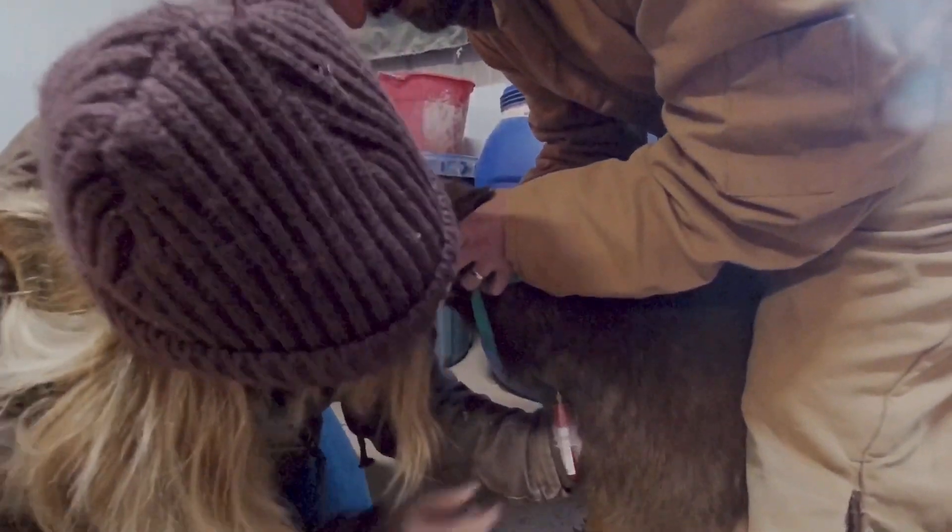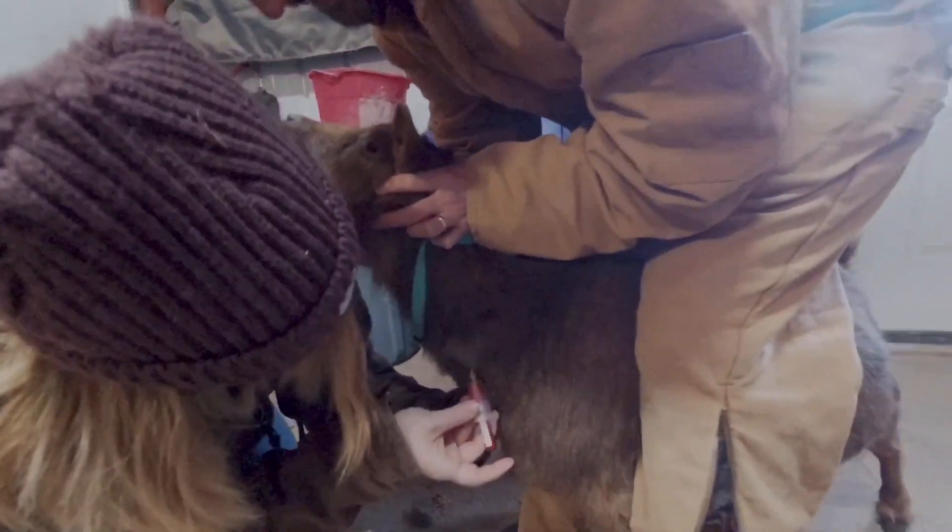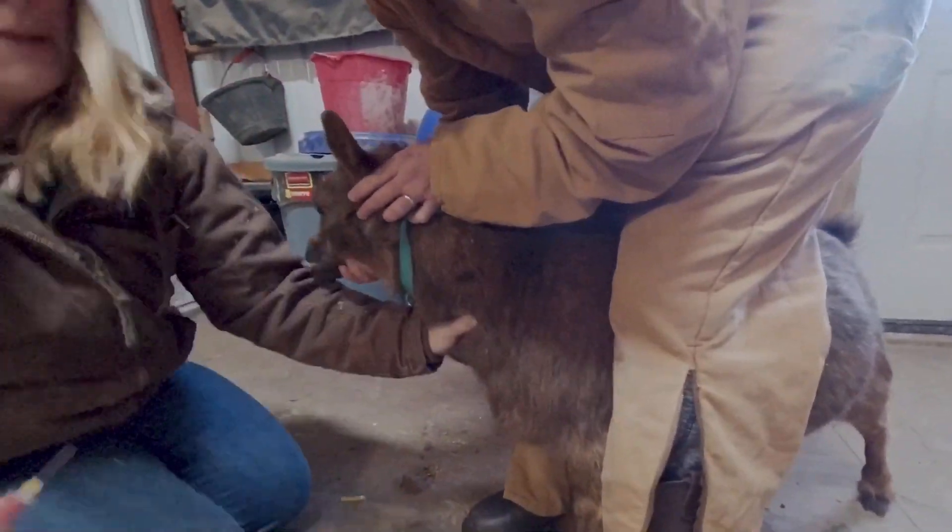In this second instance, I'm using the double-sided needle paired with the red top tube supplied by my lab. The advantage here is you don't need to pull down on a plunger — once you hit the jugular vein, the vacuum seal of the red top tube does a lot of the work for you. I find the flow is a little bit slower, which could be due to the lab sending 20-gauge needles versus the 18-gauge I use with the syringe.